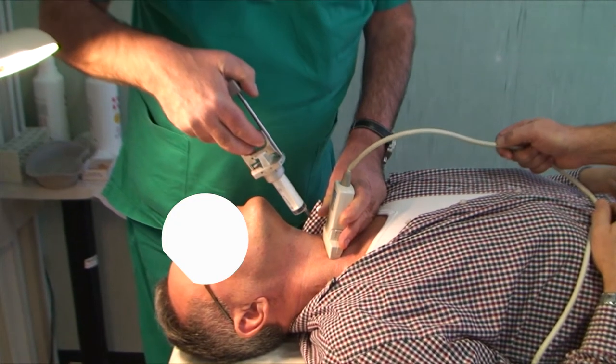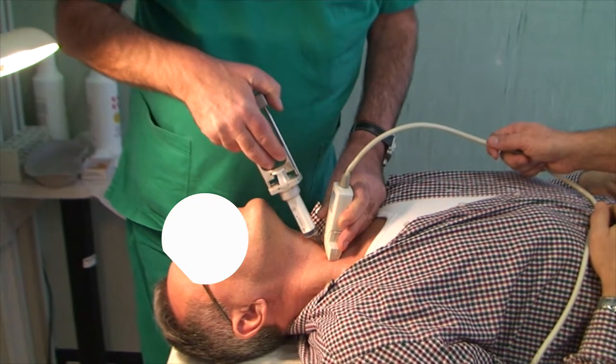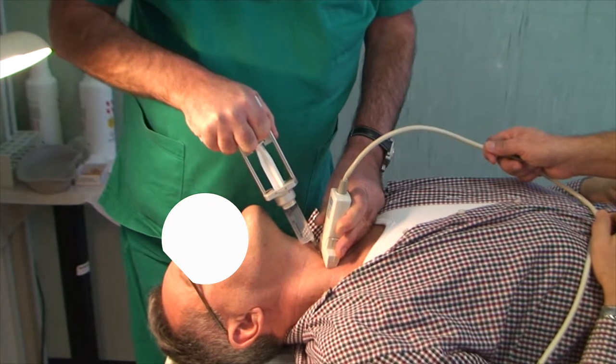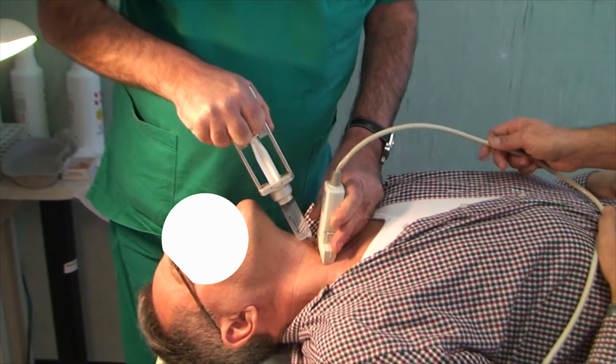Capsular invasion. The fine needle aspiration biopsy may fairly frequently give adverse reactions, such as: 1. Bradycardia and hypotension; 2. Bleeding; 3. Hiccup due to the accidental puncture of the phrenic nerve; 4. Two-tone voice due to accidental puncture of the recurrent nerve.